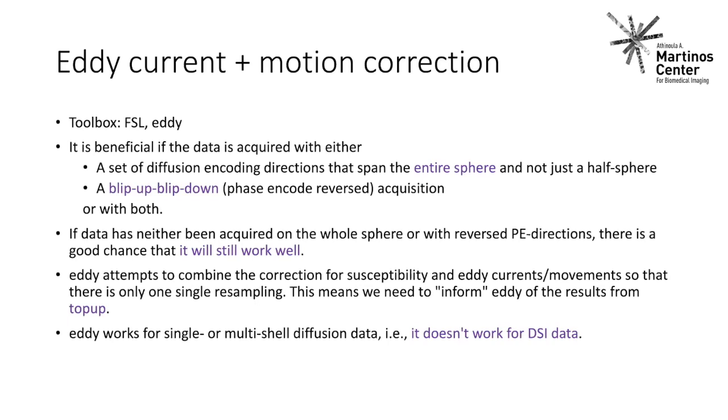So we usually use top-up first and input the information from top-up into eddy and use them together. And eddy works for single or multi-shell diffusion data, which means that it doesn't work for DSI data. But maybe you can try and it may work as well.